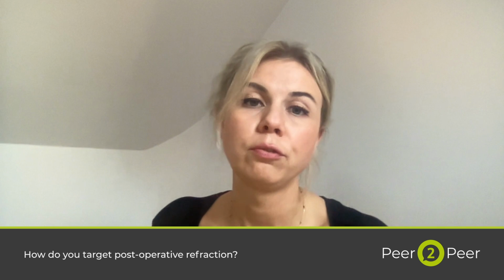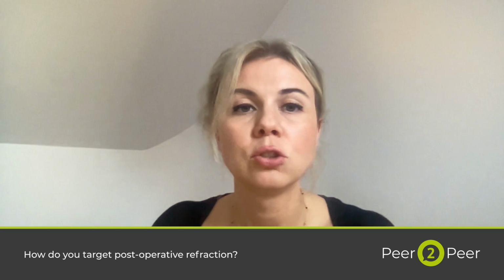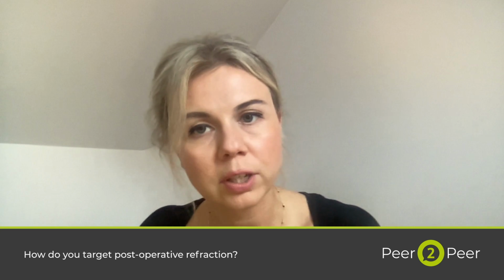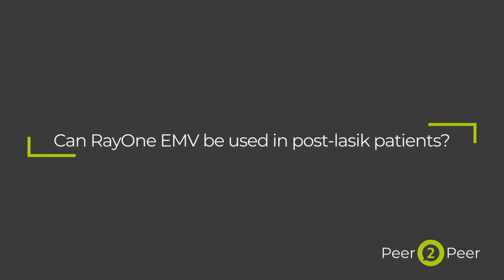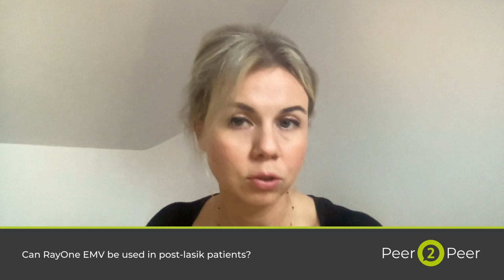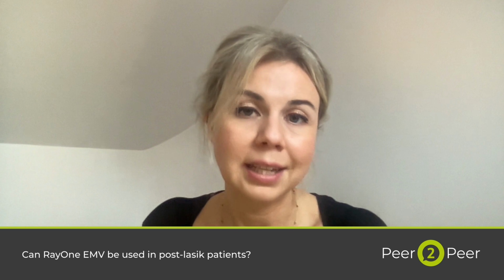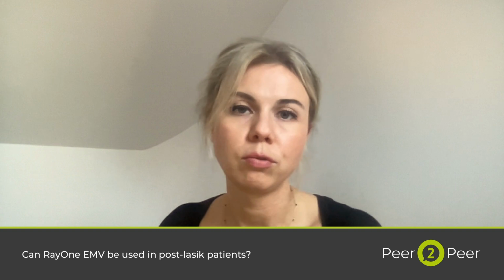When targeting postoperative refraction, we need to remember that EMV is a positive spherical aberration IOL. Such lenses should always be targeted on plano, or rather even on the first plus. With a negative spherical aberration IOL, we target a small minus, and this is the difference. Personally, I don't have any experience yet with EMV after LASIK, but I use this lens as a monofocal, so probably I would consider implanting EMV, especially after low diopter myopic LASIK with a small amount of positive spherical aberration, just to increase the depth of focus.